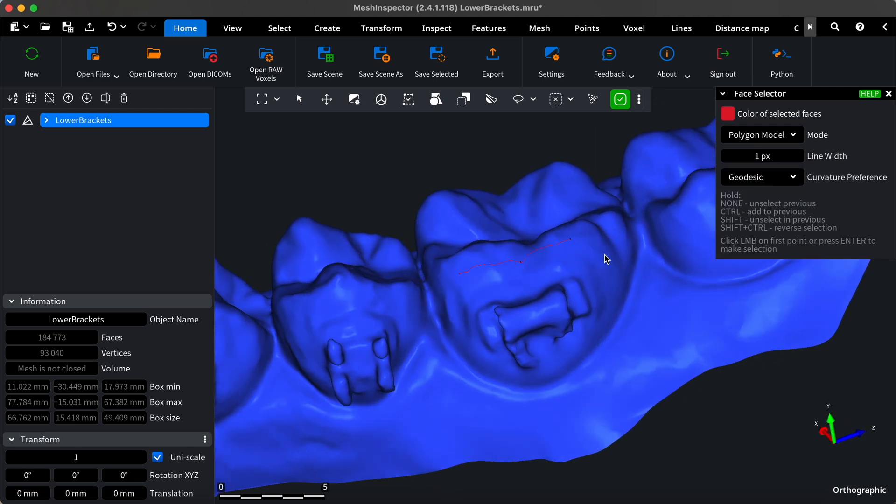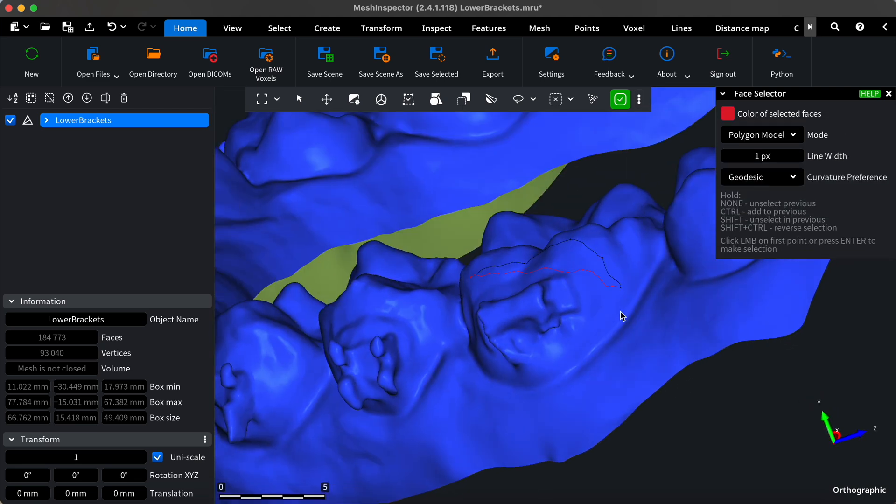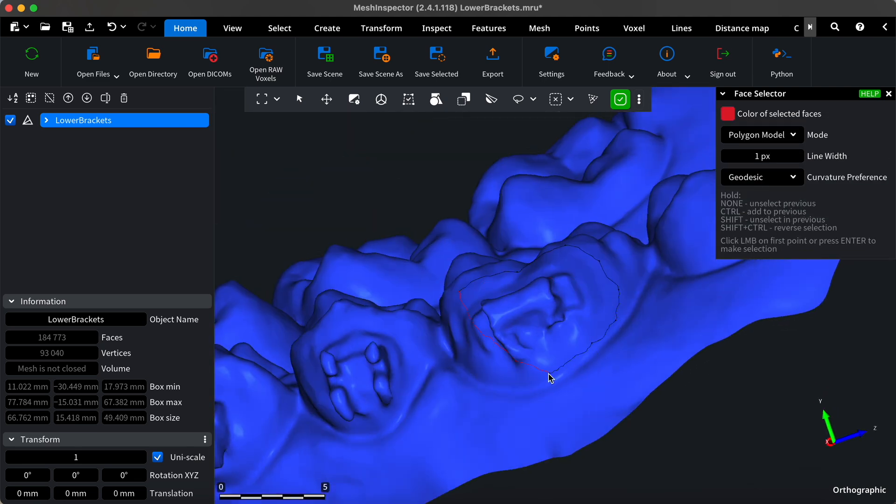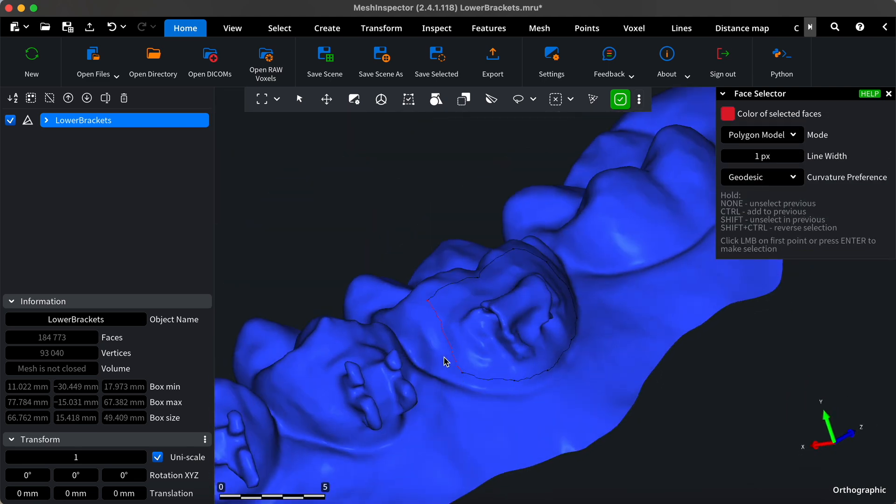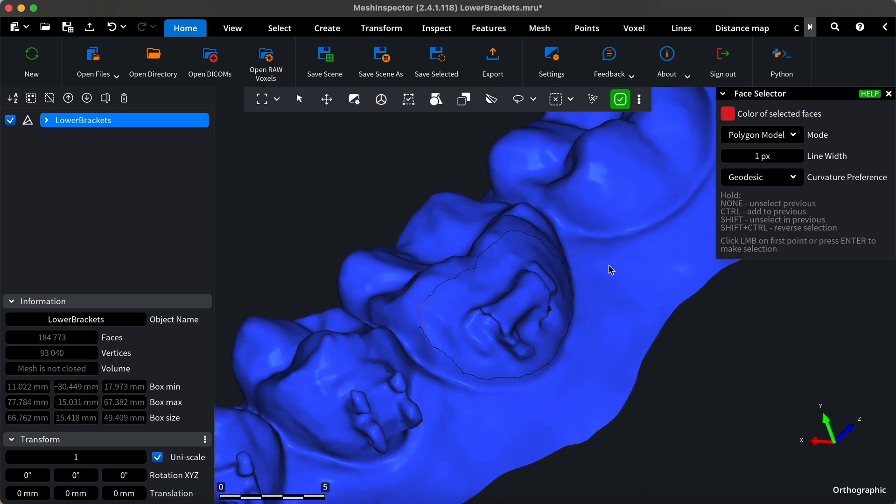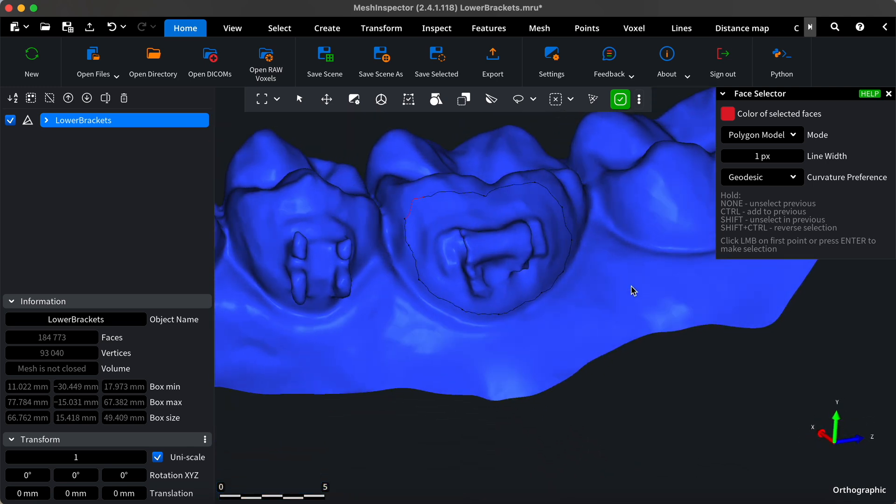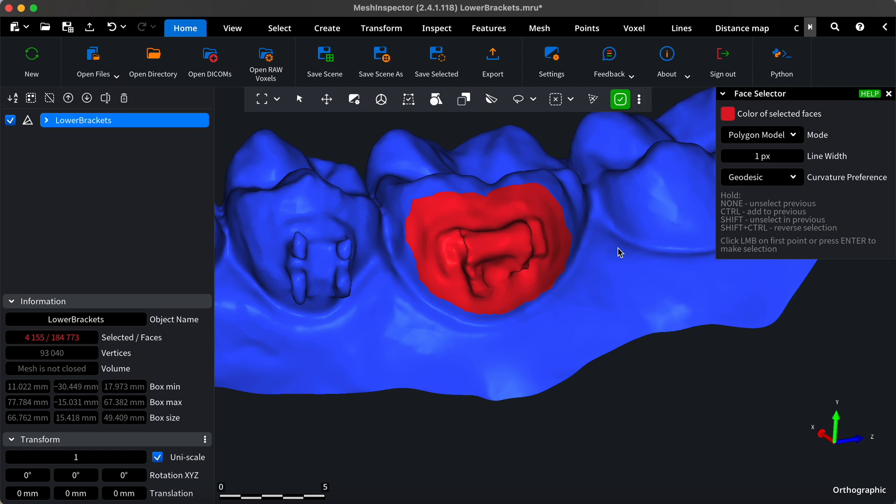Next, click the points around the brackets to outline the area you want to remove. When you've finished selecting the area, press the enter button or click the first point with the left mouse button to complete the selection.